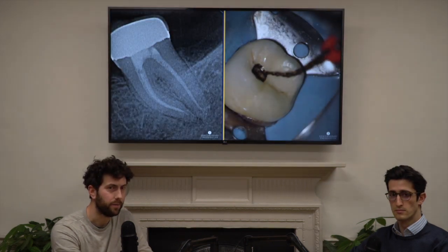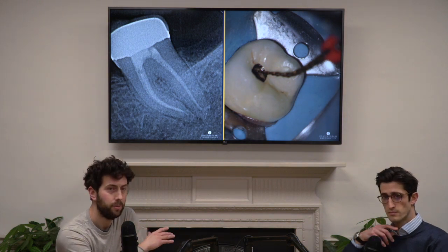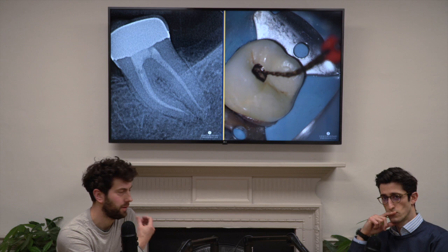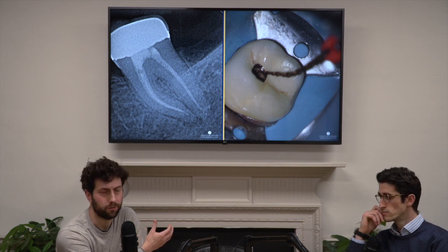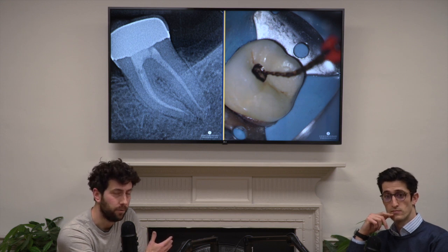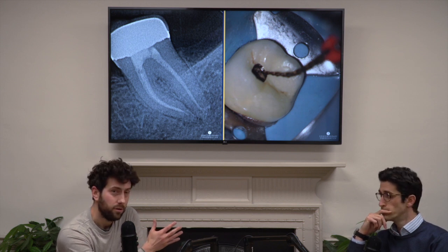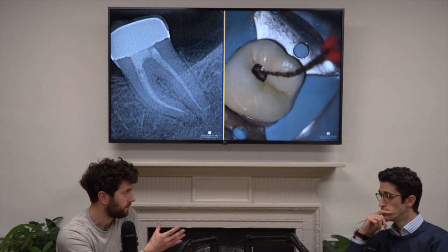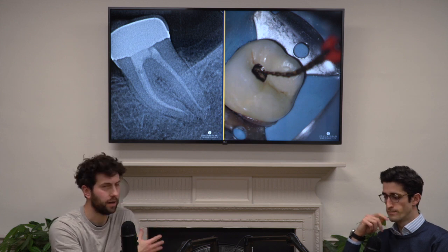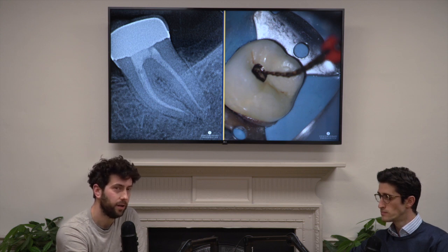And just to wind up, I think this clinical case can highlight a few of those bits. It was a case I did, a recently fitted porcelain bonded crown, flared up, irreversible pulpitis tooth. So the patient had a lot of hot cold pain, throbbing toothache, and we chose here to do this endo through the crown, trying to keep it reasonably small, but the picture shows you can pre-curve these. Traditionally, you may well have been opening things up and drilling dentine away in order to create the space. With ProTaper Next, for example, you'd have to cut quite a bit of tissue away to use here. And you can maintain the shape in that pericervical area.